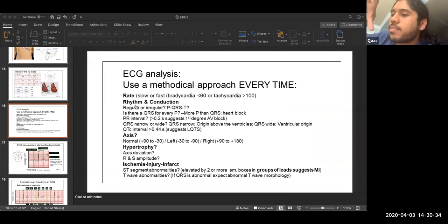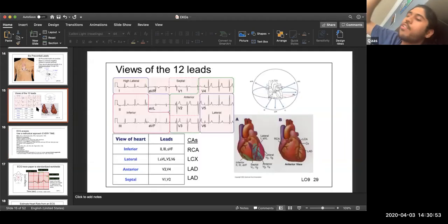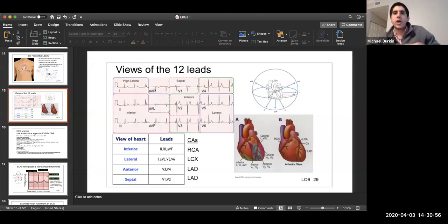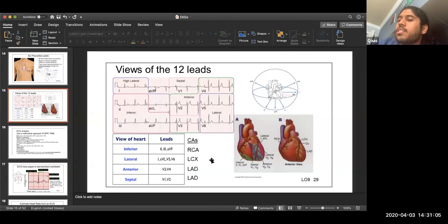The ECG machine is making those nodes on its own. So there's no extra lead. So you remember the triangle, how you have the positive node on that right lower, the left lower one, and the upper two are negative. So that's how that works. So it's not an extra lead. The ECG machine uses those leads to augment and create an artificial node system. So outside of V1 through V6, all the other ones are virtual using the LL, RA, LA, and RL leads, right? Yes. Okay. Thank you. All right, cool.